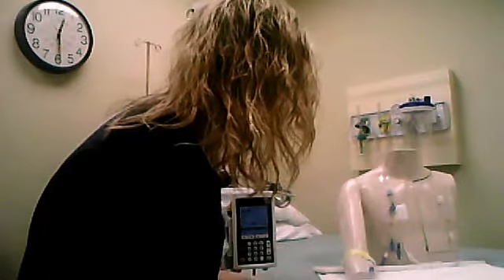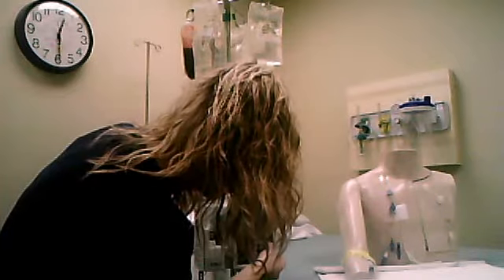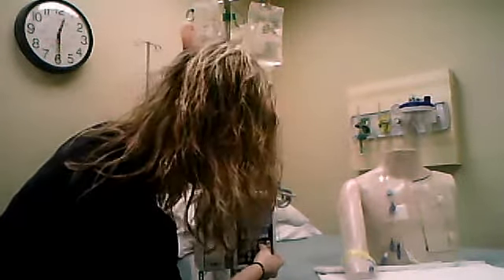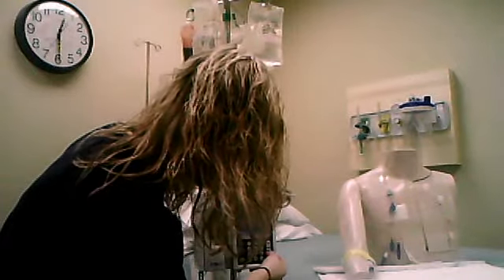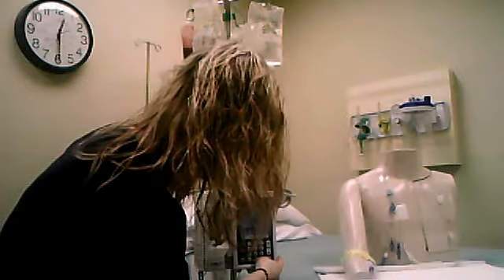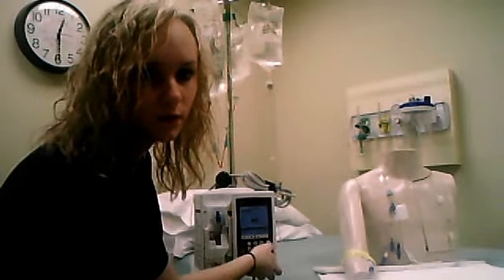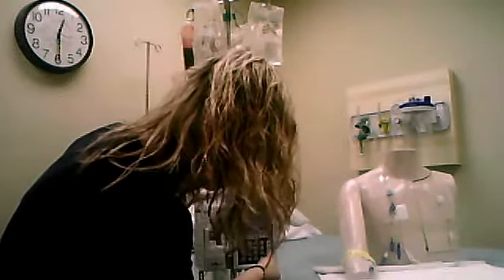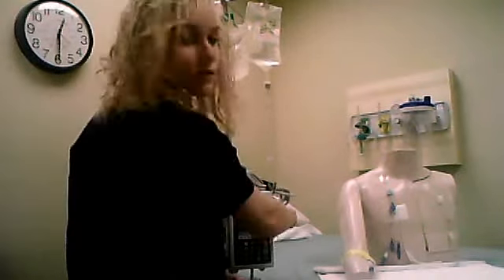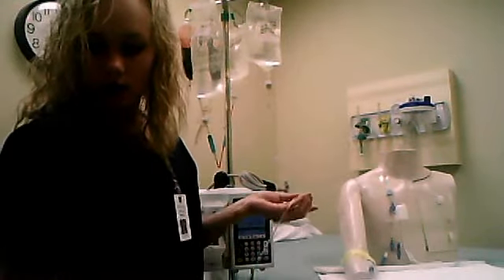And set our infusion rate for 33 mils an hour. And the volume to be infused was 200 milliliters. And that ends up being 6 hours and 3 minutes, which is just perfect for what was ordered. So we can go ahead and start that and lock the safety on the back again because that'll be running for quite a while.